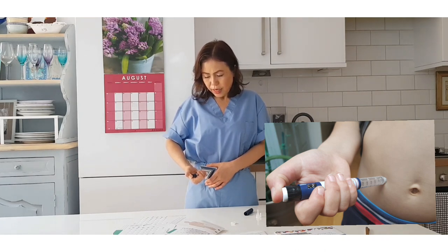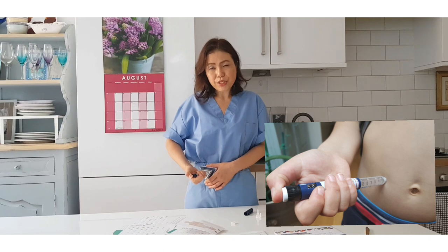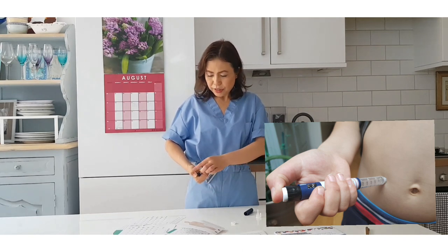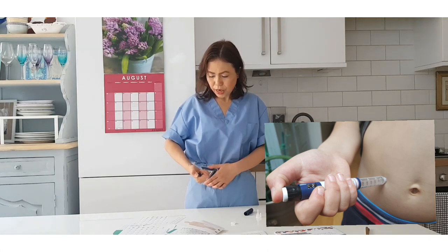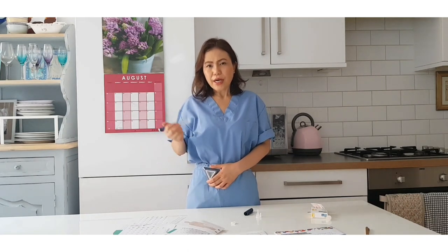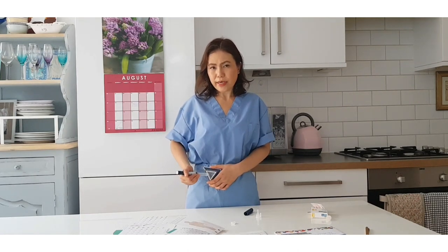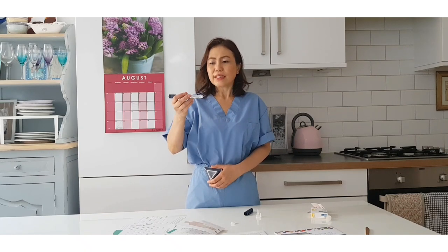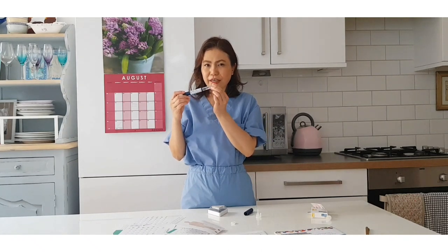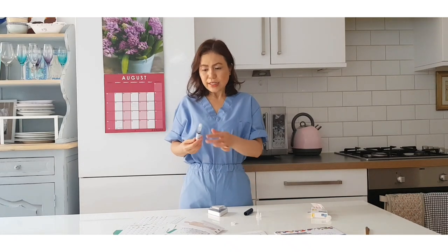Press the plunger until the number has gone back to zero. Once it's at zero, start counting one to ten - one, two, three, four, five, six, seven, eight, nine, ten - while still pressing the pen with your thumb, then pull out. The reason for counting one to ten is that if you don't, the insulin is still dribbling at the tip, meaning you're not getting the exact amount of insulin that you've been prescribed.